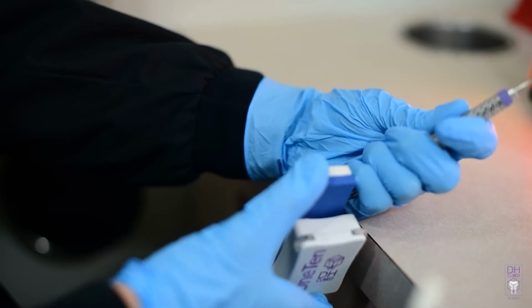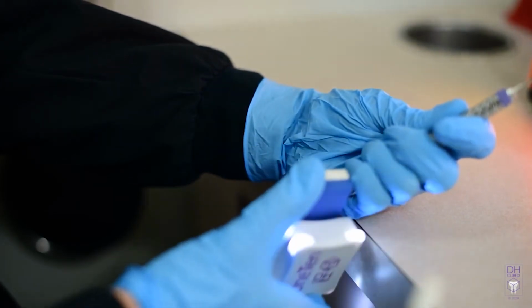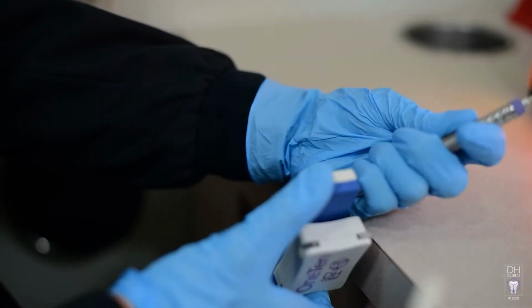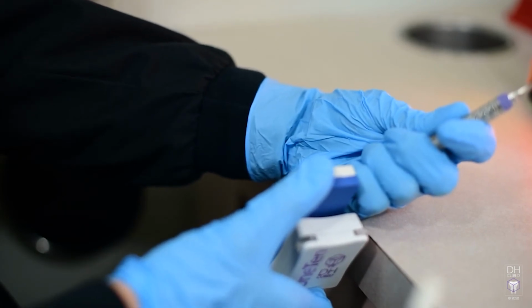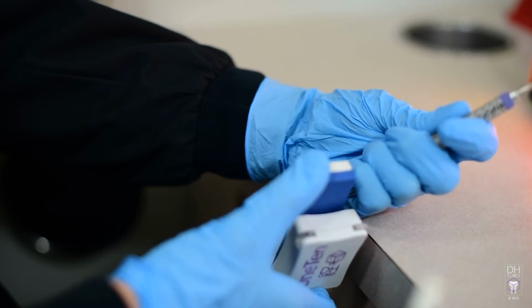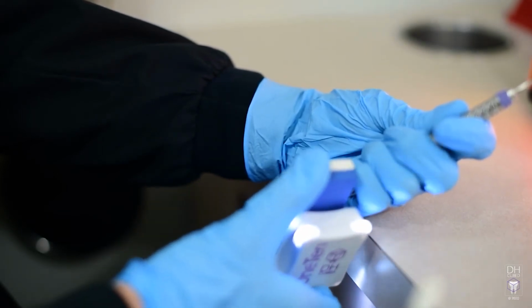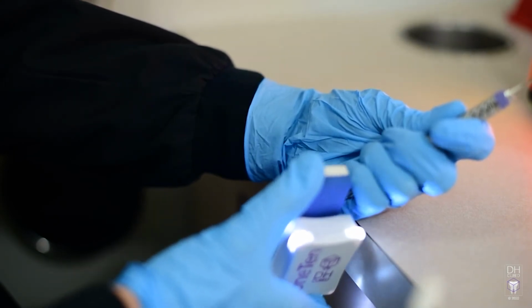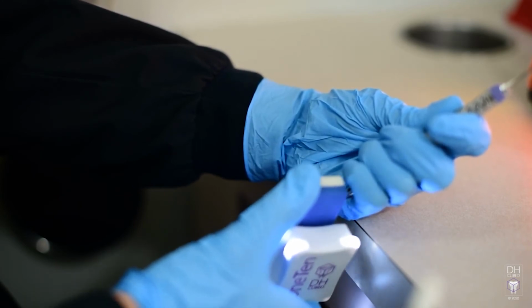If seated, we do not recommend stabilizing your instrument on a countertop because it can make your wrists come out of the neutral position, potentially causing strain. Keep your wrists as neutral as possible to prevent strain or possible wrist injury. If you do anchor your wrist on the countertop, then stand up and lean over the instrument. This will straighten out your wrist. One end of the instrument will always cause you to bend your wrist. If you stand or sit to the side, you will reduce the possibility of wrist fatigue.